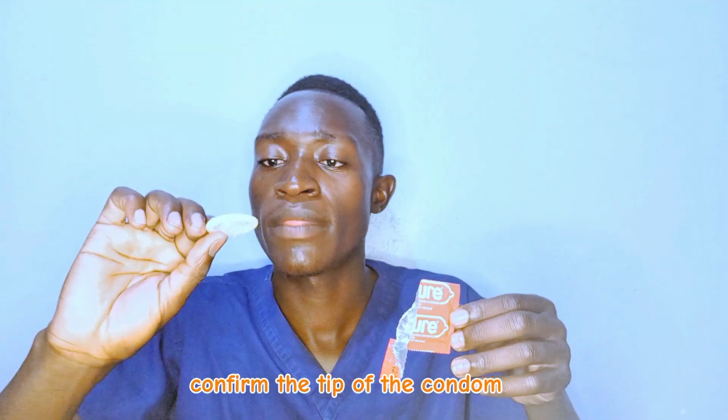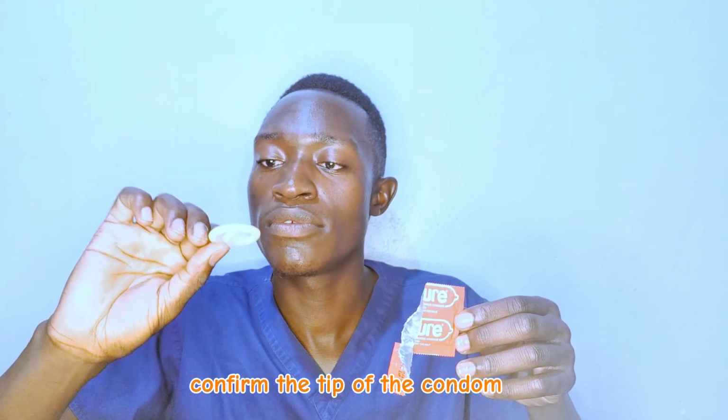You need to check the tip of our condom. We'll find that our tip is on this side, on the bottom side. You need to confirm the tip so that you know the direction in which the condom will roll.